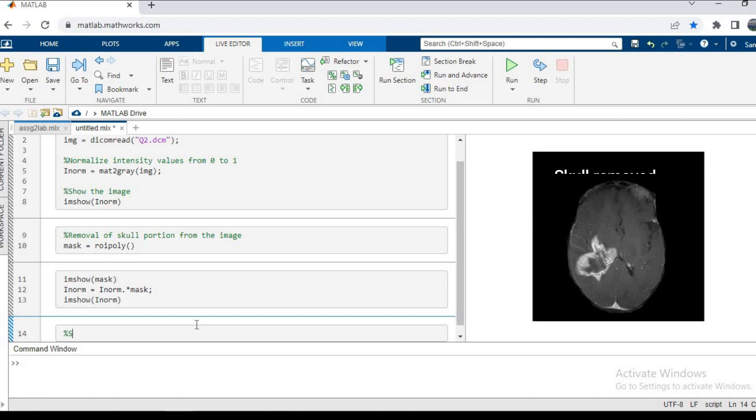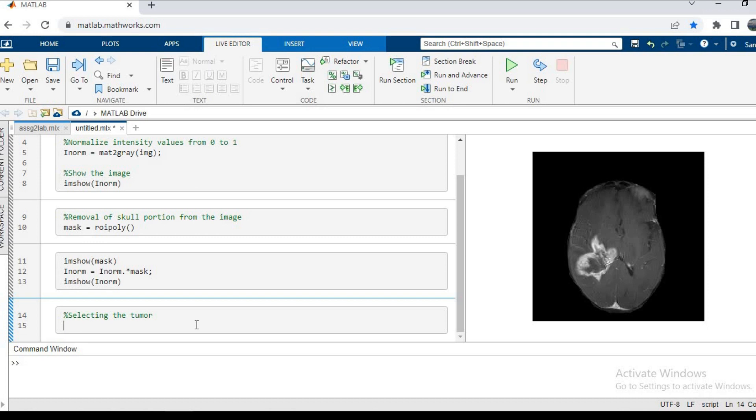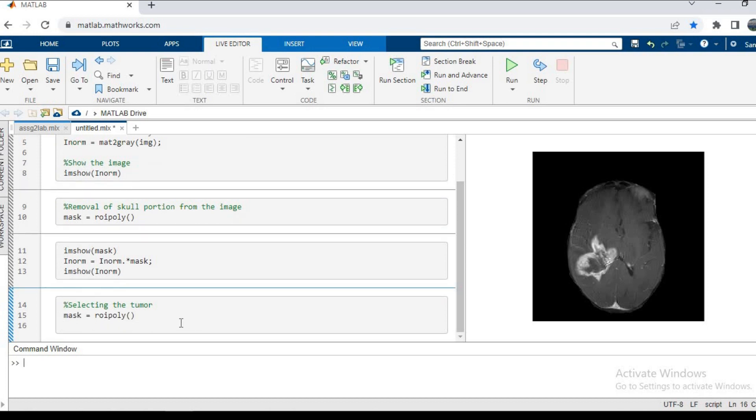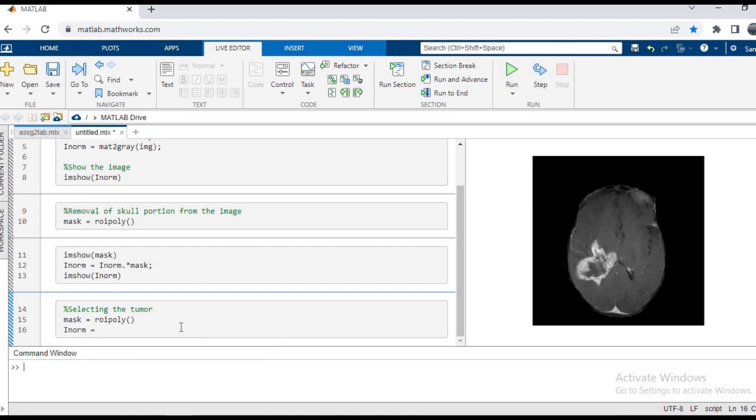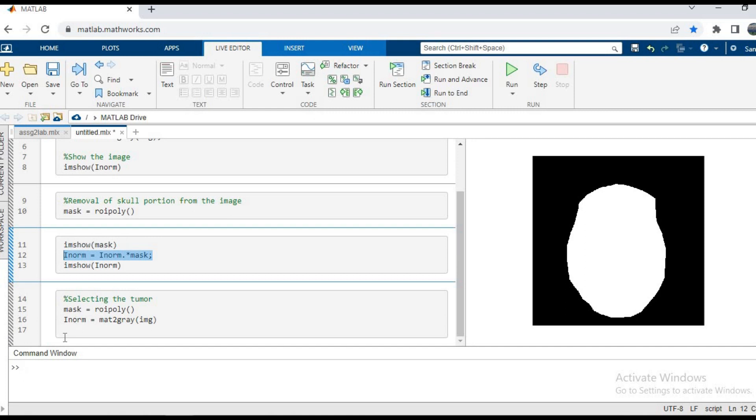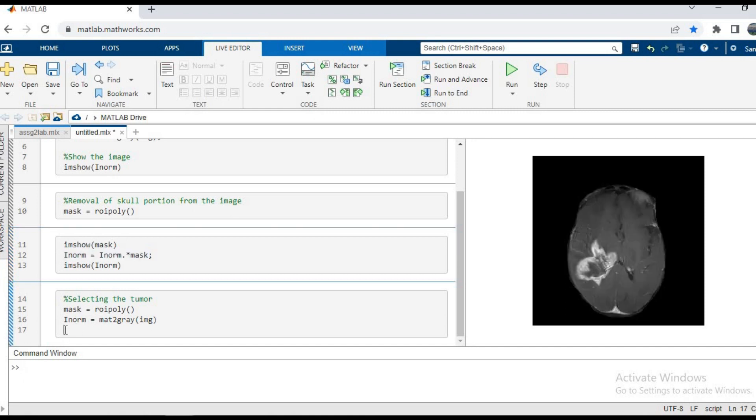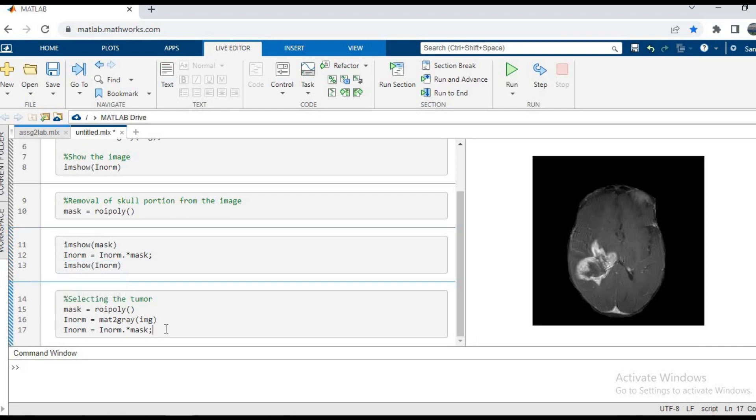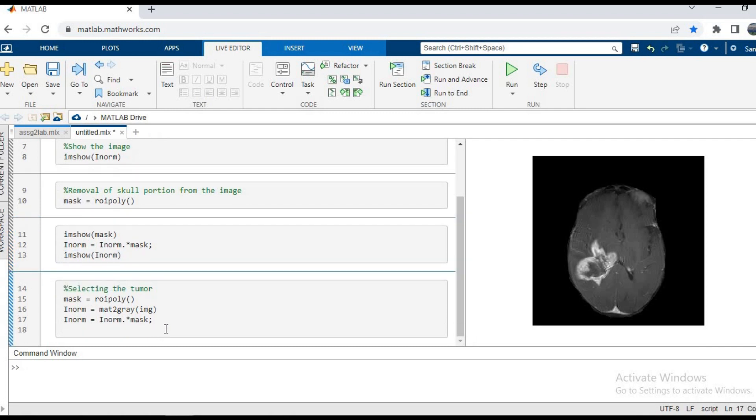Similarly we can also select a tumor from our brain tissue. I'm going to use the mask equals roipoly function before, and then I'm going to load the image in my inorm matrix with the mat2gray function. So inorm equals mat2gray bracket img, and then I copy the code from the previous instance: inorm equals inorm dot multiply mask, and then imshow bracket inorm. We'll press Control+Enter.